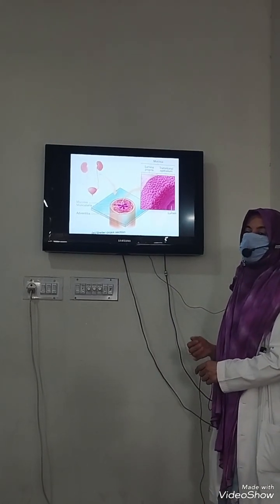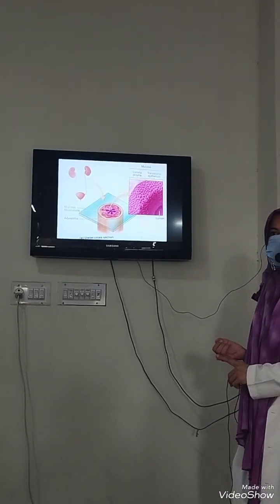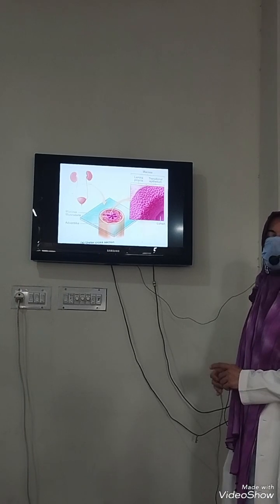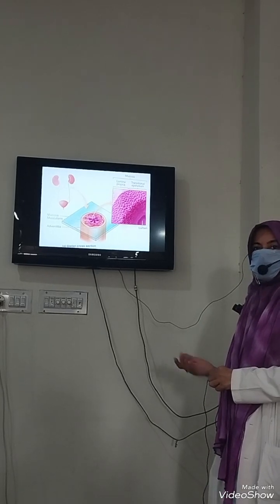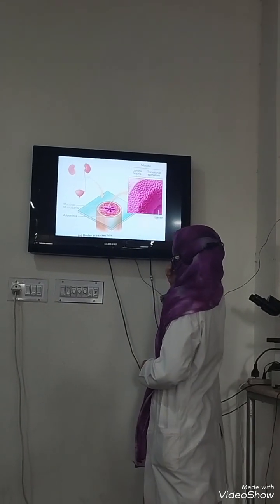Okay. And as we know that mucosa consists of three layers. What? Number one, can you help me out? Epithelium. Yeah, this is epithelium. First there is epithelium, so don't forget. Then comes the lamina propria, very good. And then the muscularis mucosa, that may or may not be present, but we have to focus on the structure. So this chunk is being highlighted.